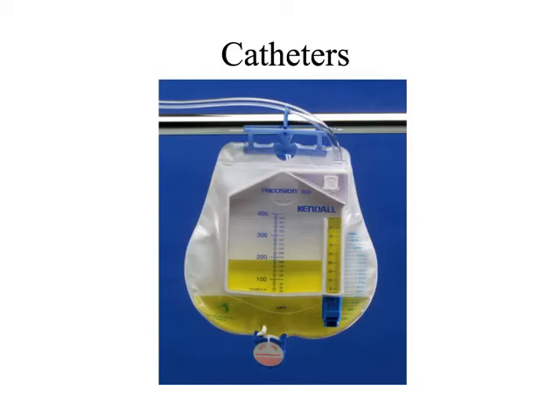But they have the little clamps already built onto them. I know they do, but the problem with using those clamps is what? You can't sometimes get them off. True, what else? Why would I just want to use my own hemostats on doing this?